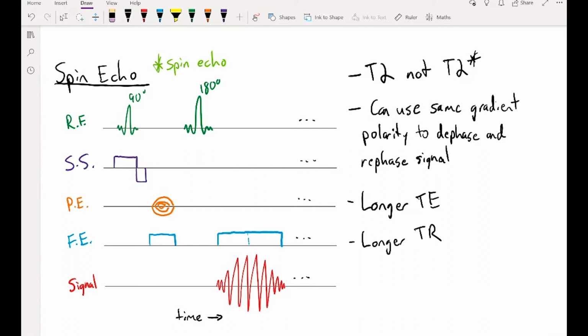So in order to help us tease apart the phase side of that equation, what we need to do is repeatedly vary our phase condition with different gradient amplitudes, both positive and negative, and then put all of that information in a two-dimensional phase and frequency space into our Fourier transform, which helps us build an MRI image. So let's talk about how that is actually done.